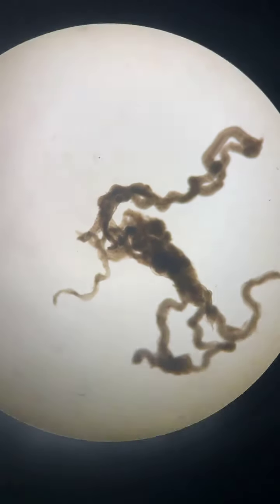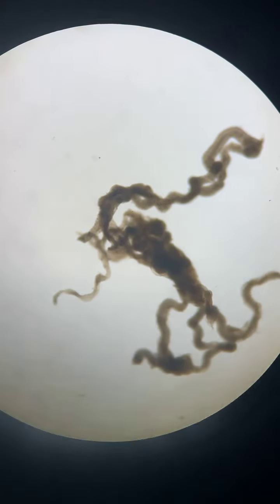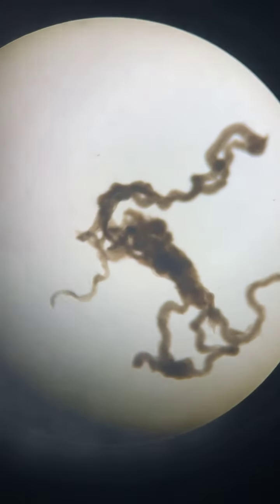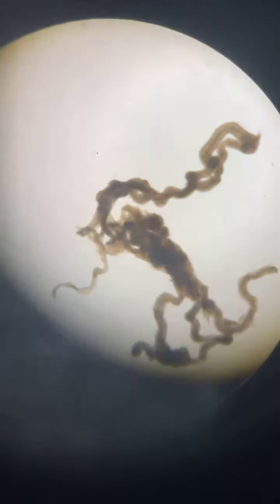There are certain aspects which are very important. This tubule seems to be slightly healthy — this is a good tubule. I think from this tubule I will be able to probably obtain some sperms. I'm going to show you the exact technique.